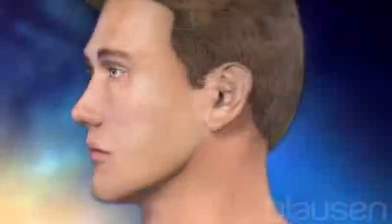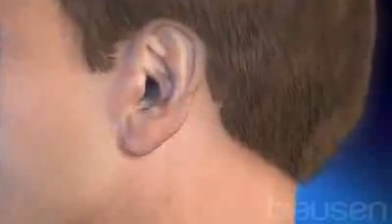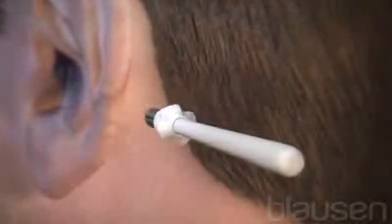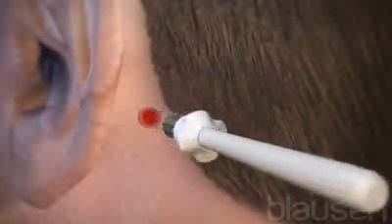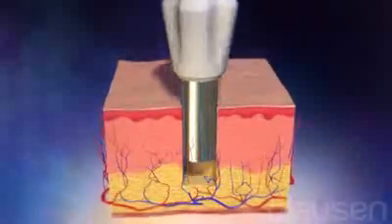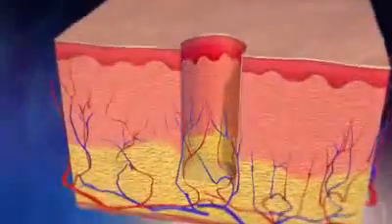A punch biopsy is used for obtaining full-thickness samples of the skin. A special instrument called a punch is used to create a small hole or punch in the skin. This punch works much like a cookie cutter to remove the entire core of tissue, epidermis, dermis, and fat. A punch biopsy requires sutures to close but leaves minimal scarring.